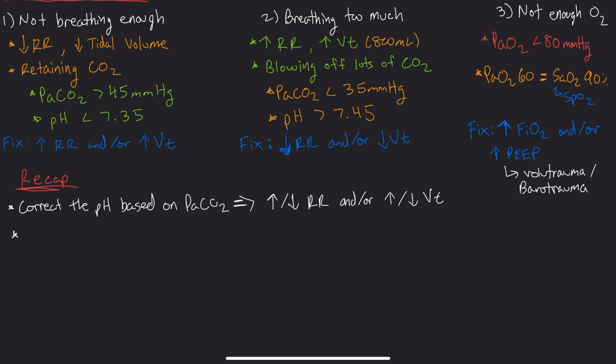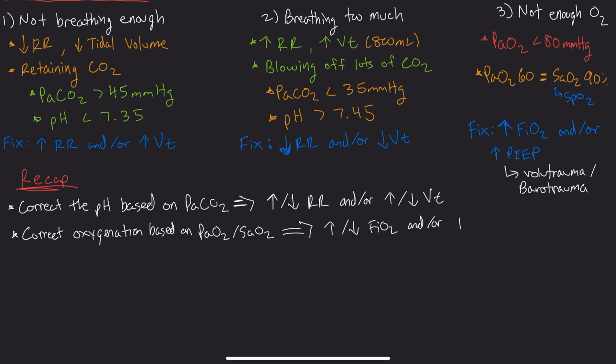Then if you're trying to correct oxygenation status based on PaO2, SaO2, then you can either increase or decrease the FiO2 and/or increase or decrease the PEEP.